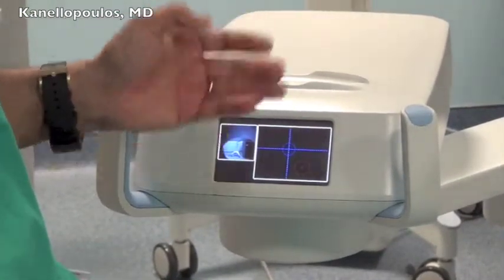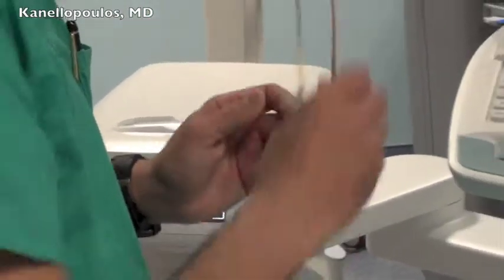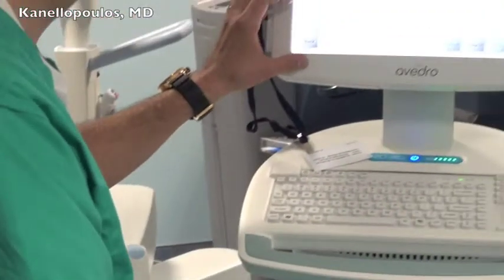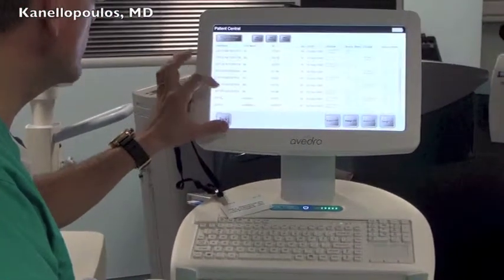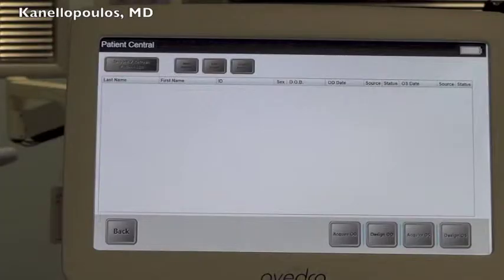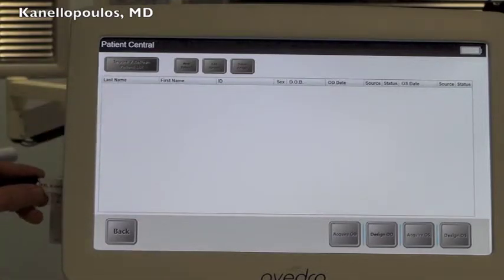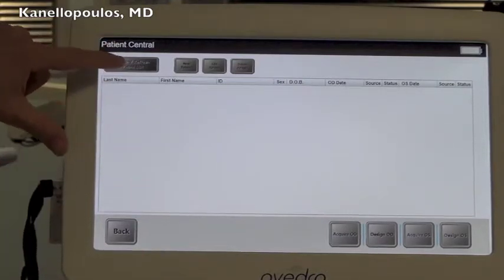patient during the procedure. What's very exciting with the PiXL 2 is the fact that we can really customize treatments to pretty much any extent. Okay, let's see now how we can use this device to import treatments. One way of importing treatments is through a flash drive, and this is the PiXL 2 preparation screen. We're inserting the flash drive with a predetermined treatment.